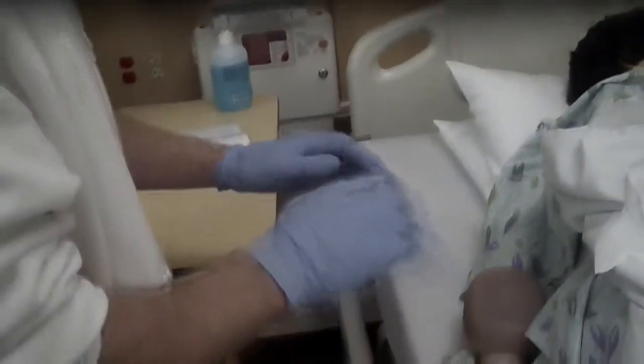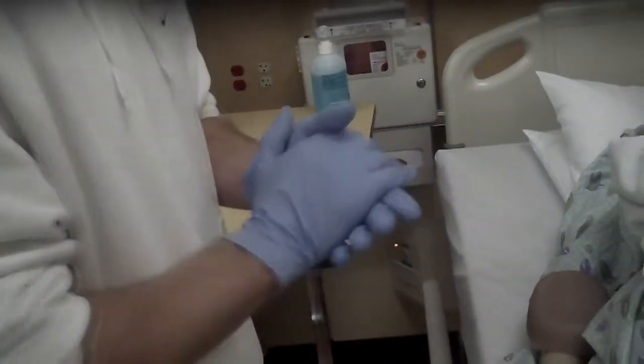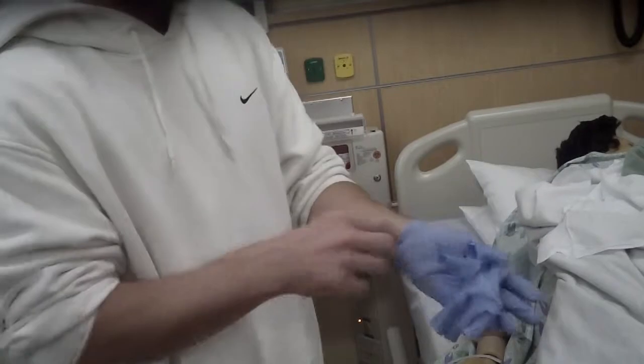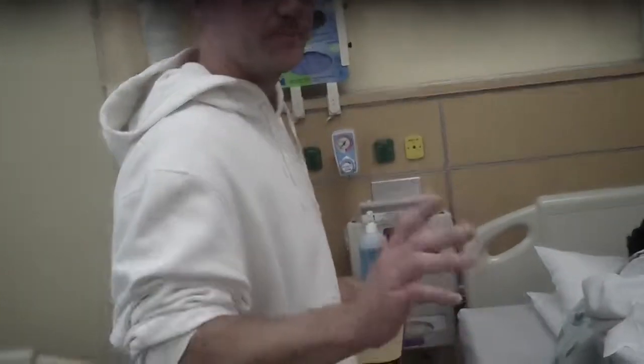I'll then instruct, which I won't be throwing that in the sharps container because I'm going to need that. I'll then instruct Mr. Smith not to scratch, not to massage that site. And then I will come back to reassess him in about 48 hours to see if he's got a mark any bigger than a centimeter.